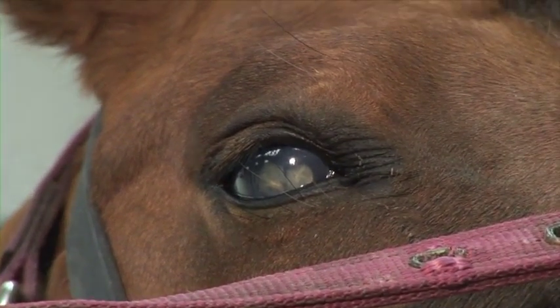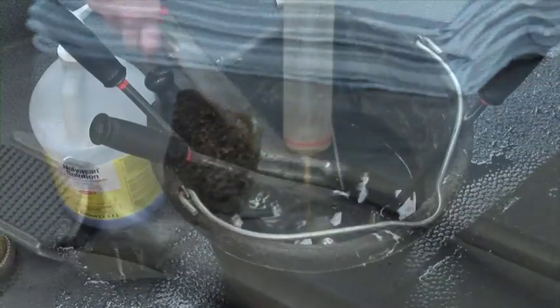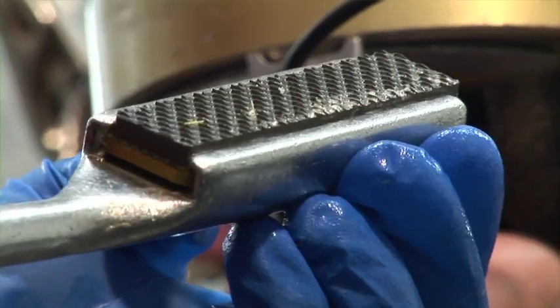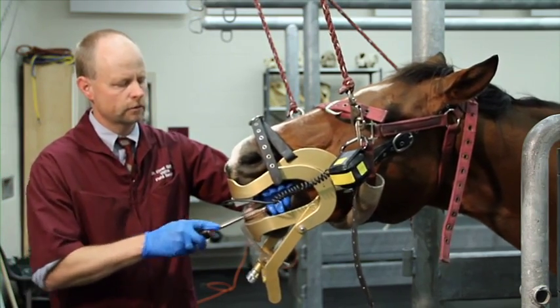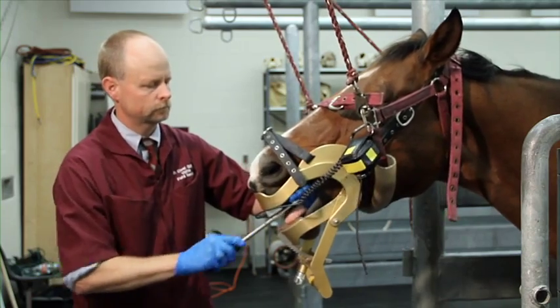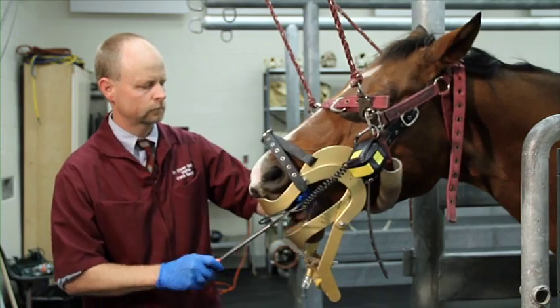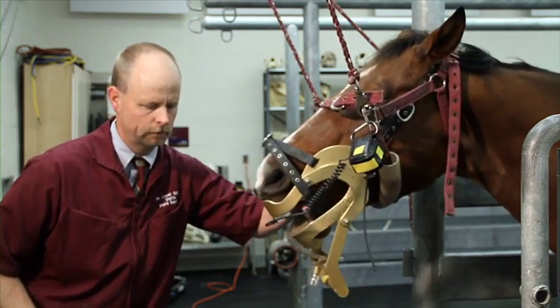To help remove and smooth the sharp points in Aggie's mouth, one option is to use a hand file. There are different lengths and configurations of hand files depending on what portion of the mouth is being worked on. We'll demonstrate on one side of the lower cheek teeth — placing the file in the appropriate position and making short pull strokes. We then reach in with a hand to verify that the floating procedure has been successful and everything feels good on that side.